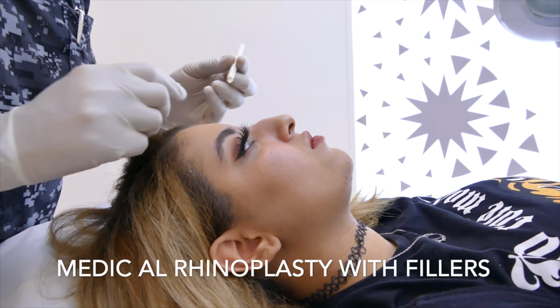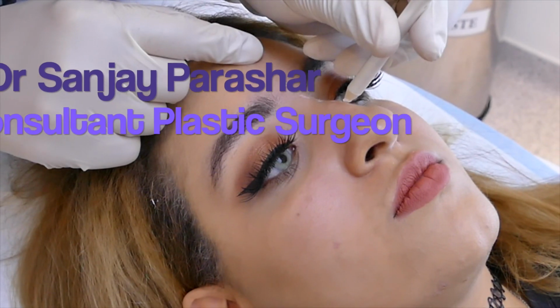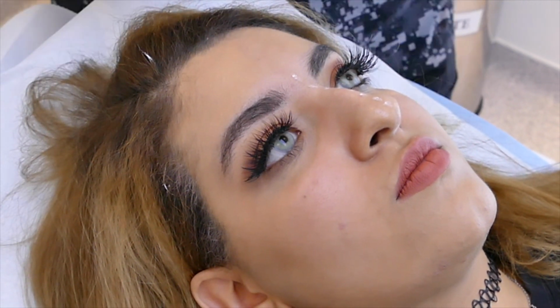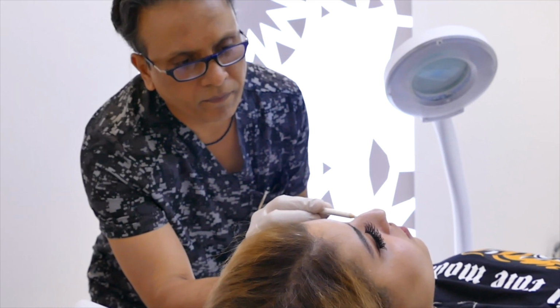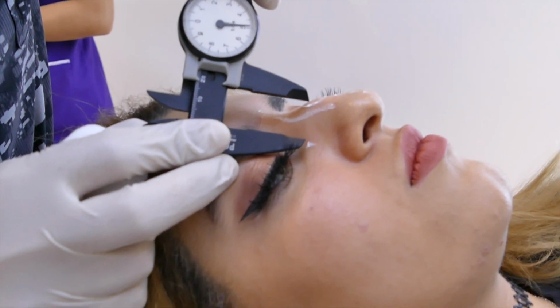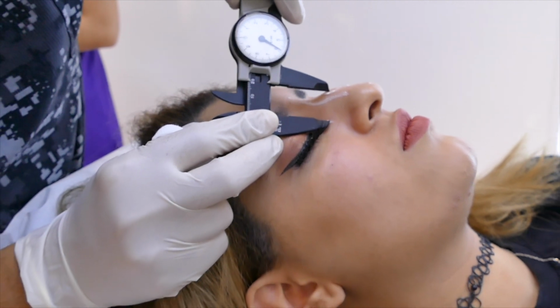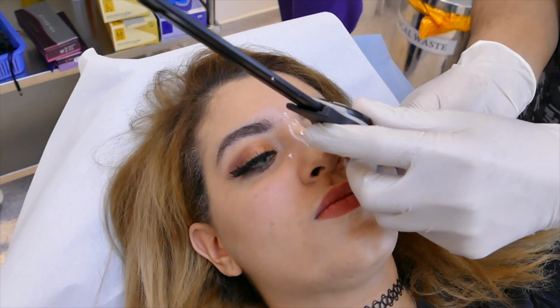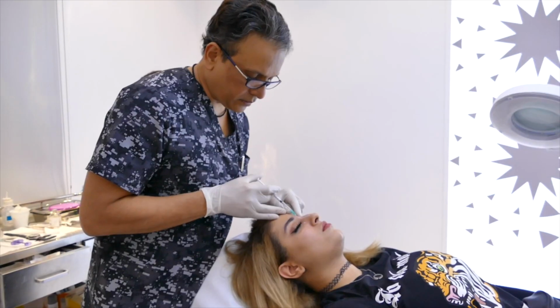This is a patient with a hump deformity in the nose and a droopy tip. So I am going to do a medical rhinoplasty. I am marking the midline, then I will mark the nasion and the tip defining points. I will measure the hump height so that I can proportionally increase the height proximal and distal to the hump.